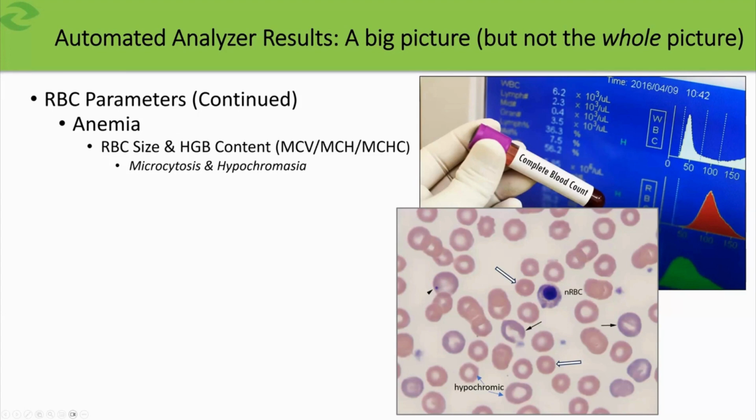The area of central pallor is increased in these cells. This cell here is probably more typical of what you would see in a dog erythrocyte, canine erythrocyte there. So you can see certainly expansion there. If we were to stain this cell with new methylene blue, I suspect that even though it's not quite as gray blue as that, this would actually be a reticulocyte and has a decreased amount of hemoglobin, even given the volume of that cell is increased.